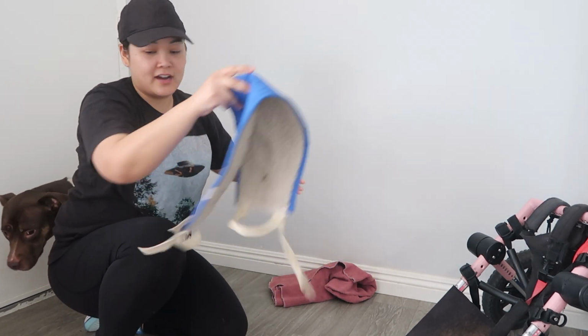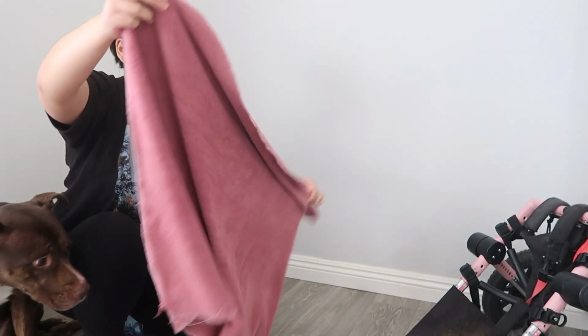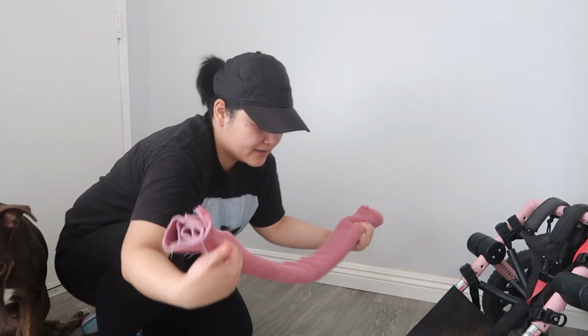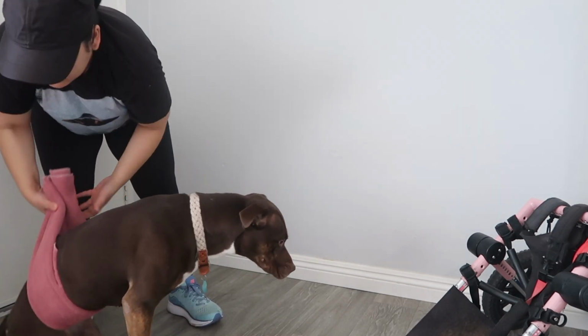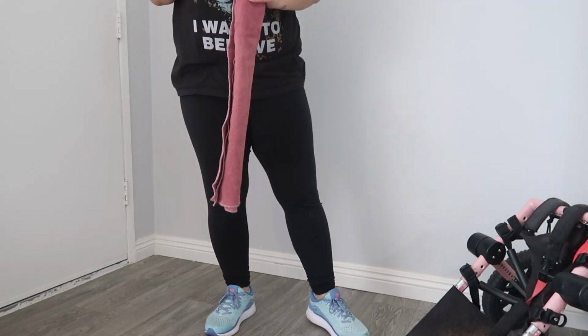And if you don't have a harness like this, you could even just use a towel. Let's just roll it long ways. Zoey hasn't gone potty yet, so I'm afraid she's gonna poop. Okay, come here. You can also just use a towel. Let's just put this under her and then lift, and then you can walk her outside to do her business and things like that. Hold on, I think she needs to poop. Okay, I'm back. I'm glad we did that off camera, because yeah, she was about to poop.